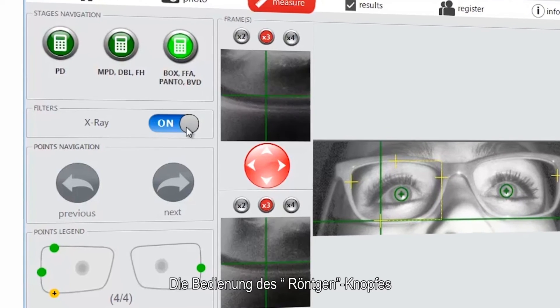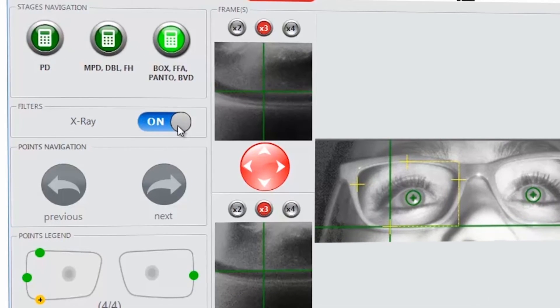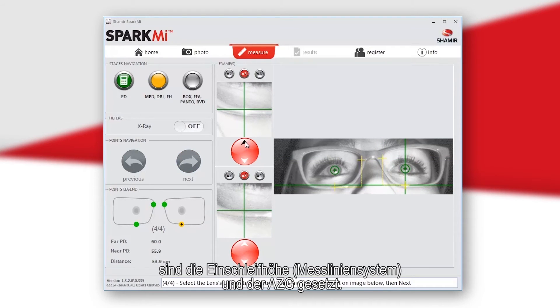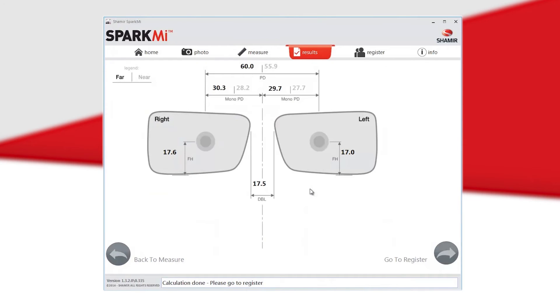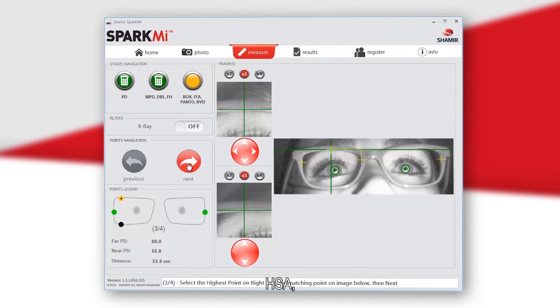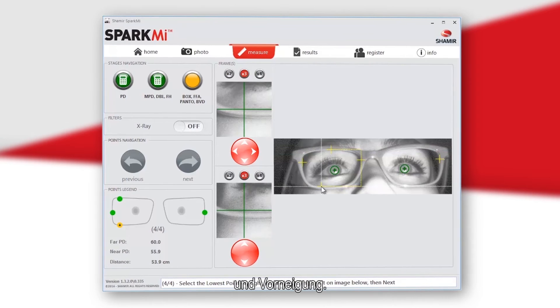Turning on the X-ray button will allow a contrast view of both small images. The first four points will measure fitting height and distance between lenses. After marking these points, the fitting height and DBL are set. You can check the results by pressing the Check Results button or continue by selecting Continue. The next four points measure the box, back vertex distance, face form or panoramic angle, and pantoscopic tilt.